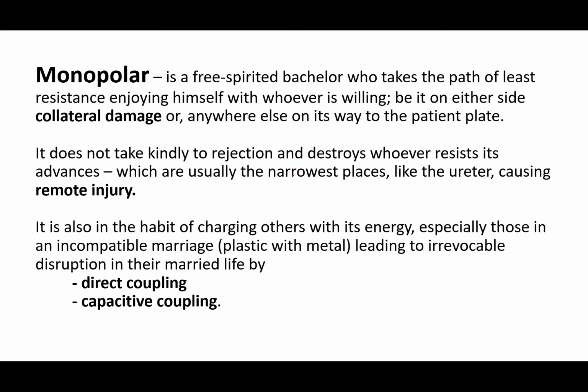You can see this free-spirited bachelor. It doesn't even limit itself. Its damage cannot be contained. You can see it can even be charging other things that are not even compatible, okay, like plastic, leading to irrevocable destruction in their marital life by what is called direct coupling, which we'll see in the complications, and capacitative coupling. So monopolar has a tendency to cause more destruction than even the bipolar, which we will see in the complications.